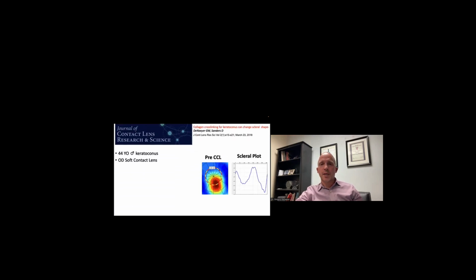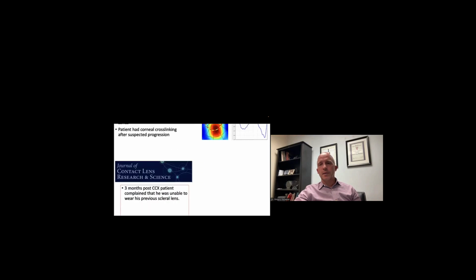And I actually had a patient like this that we published in Journal of Contact Lens Research and Science. 44-year-old patient of mine wore actually a soft contact lens in his right eye because his keratoconus was so mild. In his more severe eye, in his left eye, he was wearing a scleral lens with a toric landing zone. We thought his left eye progressed, so I sent him out for cross-linking, lost him to follow-up because he went to a different office for that procedure.